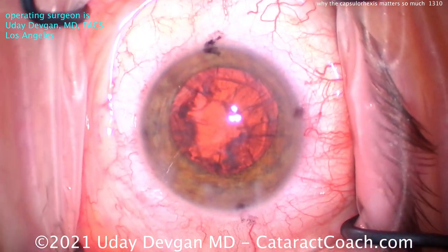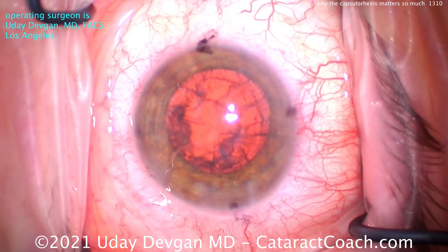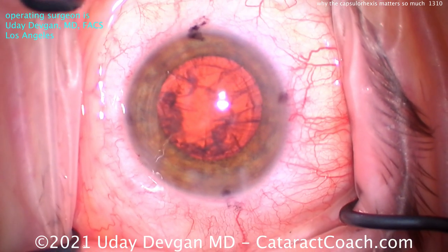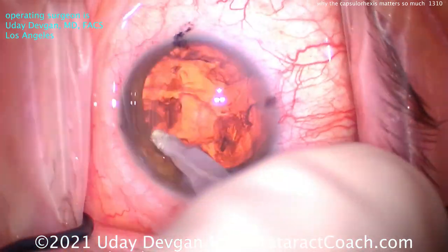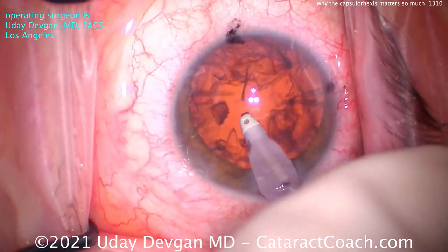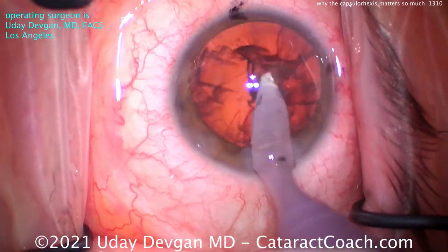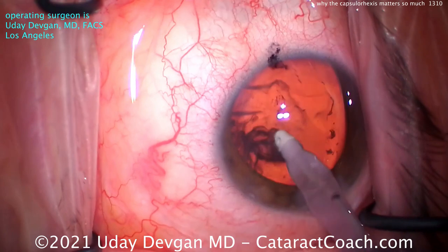Now there's another big advantage, and that advantage is in holding the IOL. So ideally, you want to have the rhexis overlap the optic edge for 360 degrees, and that's going to hold the IOL firmly in position. Remember, a lot of our lens calculations — the big issue is determining effective lens position, ELP. Where does that IOL end up in the eye?